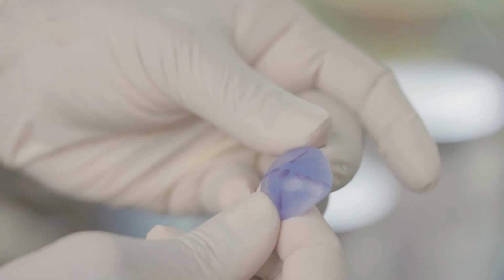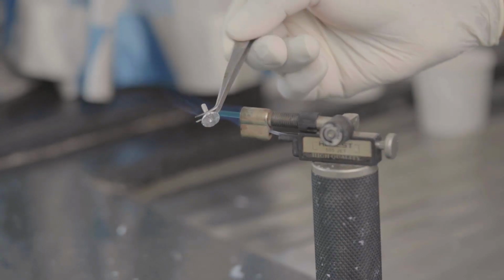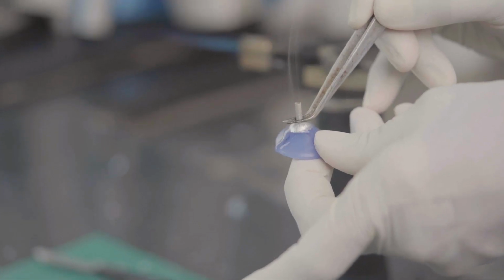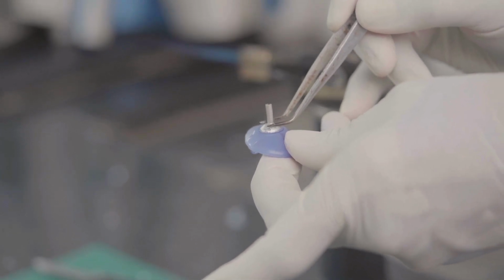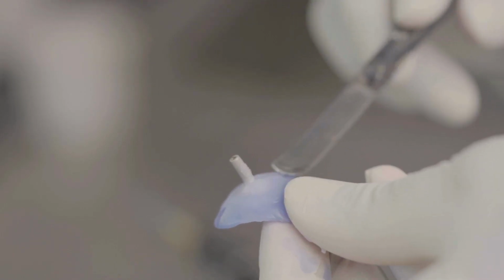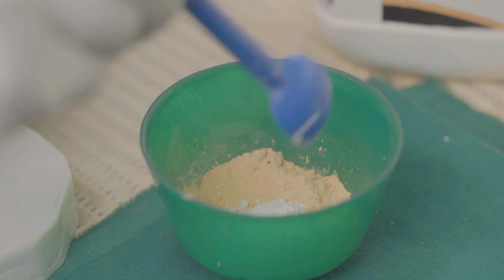Carving the wax. Once the wax mold is ready, an aluminium corneal button of the fellow eye size is taken and placed on the wax model. The wax is smoothened by carving with a scalpel blade and hot flame. Once the wax model is perfect, plaster mold.